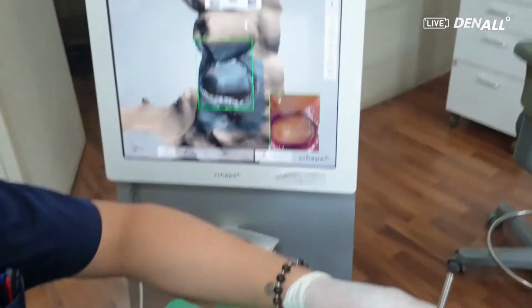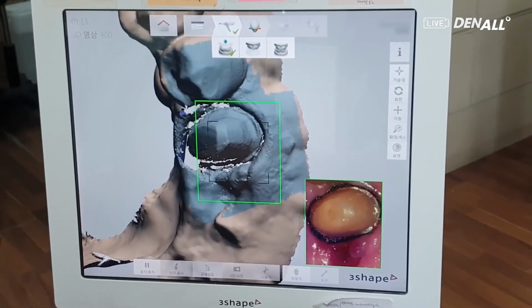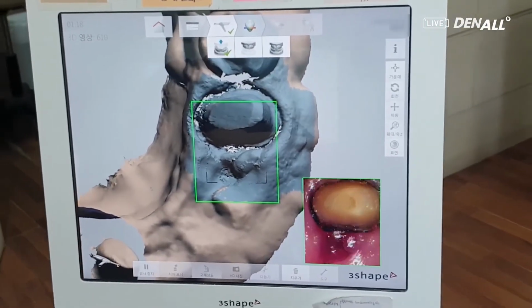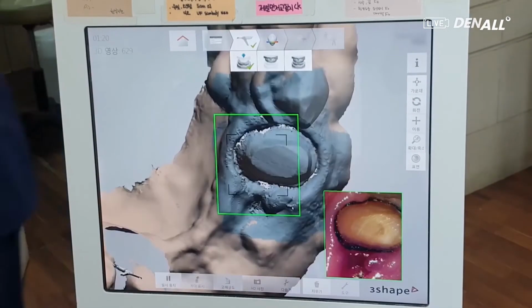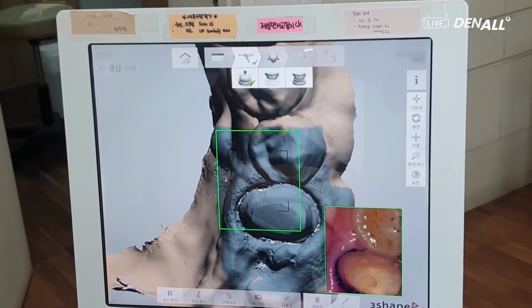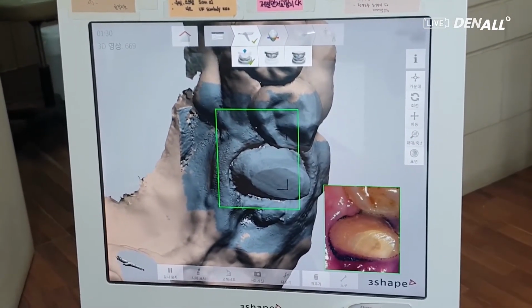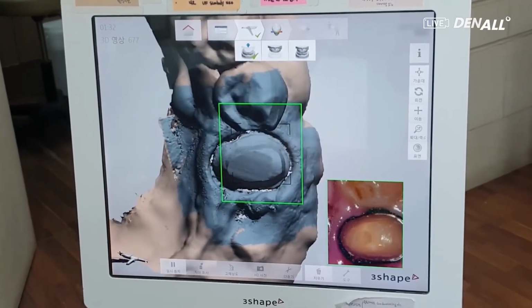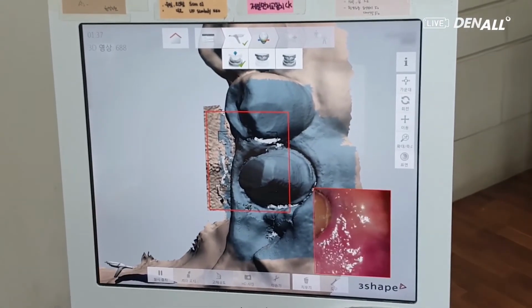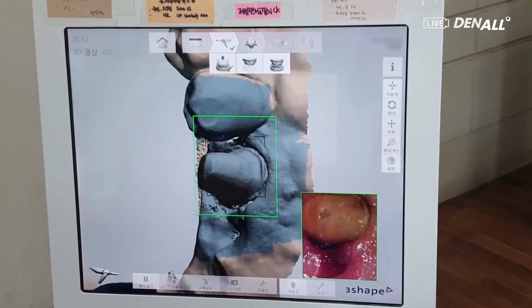This is a full arch mandible that is scanned. Abutment margin and the entire shape will be scanned more precisely using high-resolution mode. The margin is exposed clearly with gingival cord. The contact point, abutment are prepared for precise scan data. The precise data with clear margin is required to fabricate prosthesis without a model.